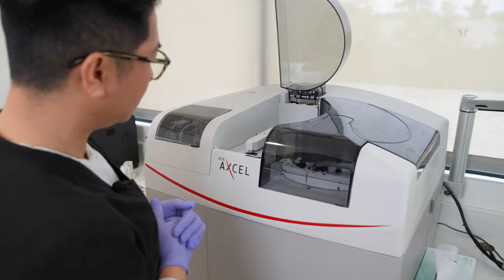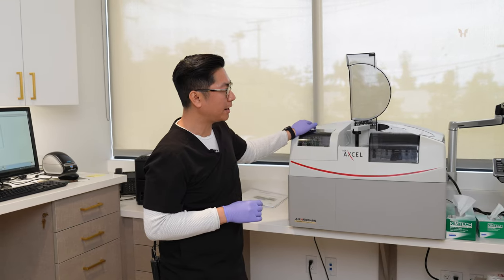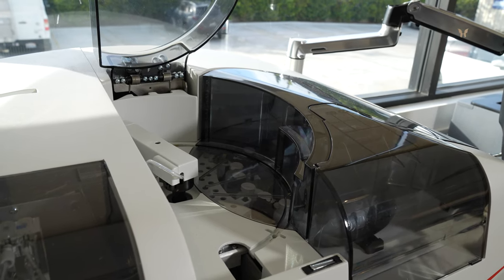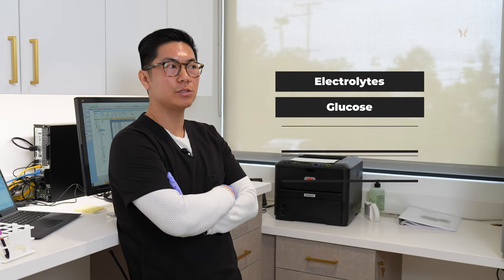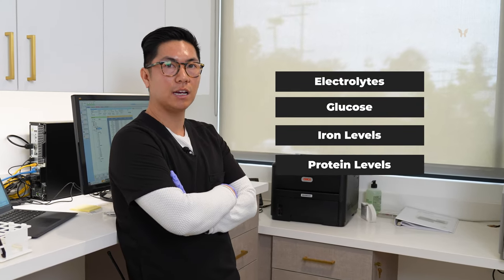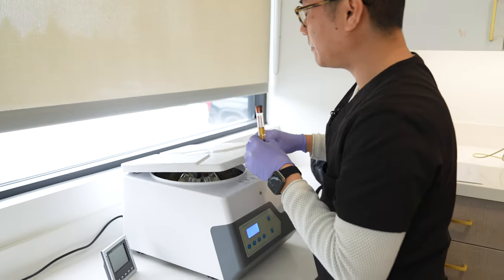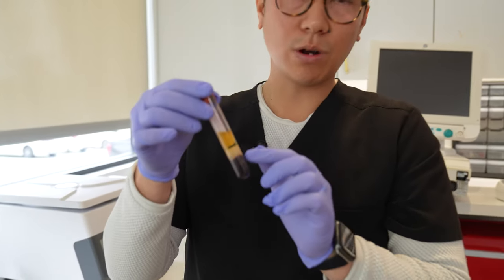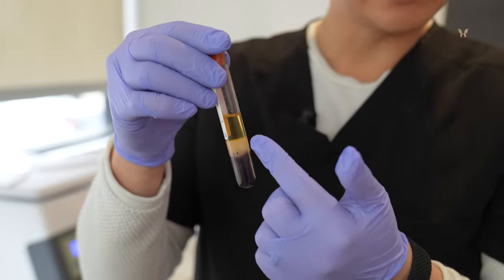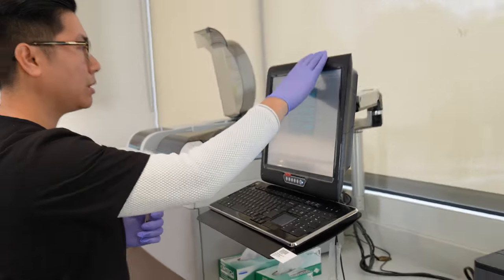The other test we'll run uses the Alpha Wasserman machine. This one runs our CMP — the Complete Metabolic Panel. In layman's terms, it measures all of the electrolytes, glucose, iron levels, and protein levels. The blood has been spinning for about 10 minutes now, and it's separated out nicely. What we're targeting here is just that yellow serum — that's what we need for the chemistry part of our lab for this patient.